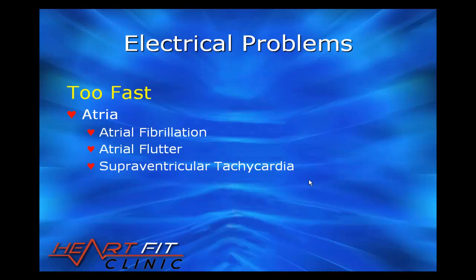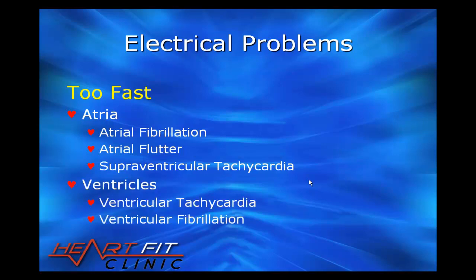Atrial flutter is not as common, but of course can happen along with atrial fibrillation. Supraventricular tachycardia is where the atria is firing so rapidly that the P waves are really hidden. Atrial arrhythmias are not really life-threatening, but should be looked at, as they can be treated with medications or even procedures. Prolonged atrial arrhythmias need to be looked at as they can lead to clot formation resulting in a heart attack or even a stroke.